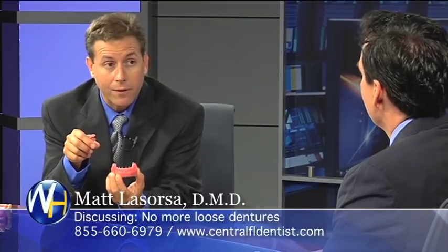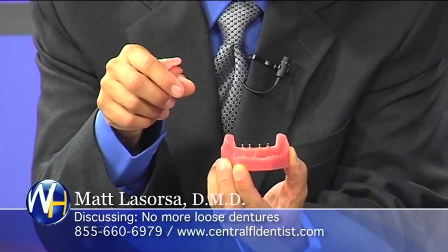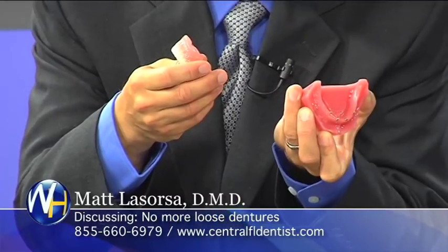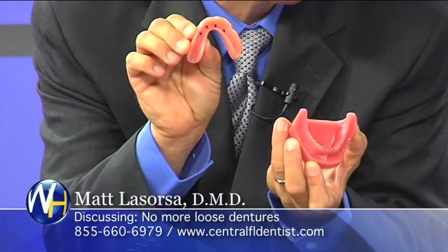So they're not a candidate for conventional implants. They just won't fit. But here's what we can do in one day. We can put these 4 mini implants in. Notice there's no incision. So this is what it looks like. Here's the 4 mini implants down below. And then what we do is we put these housings inside the denture.